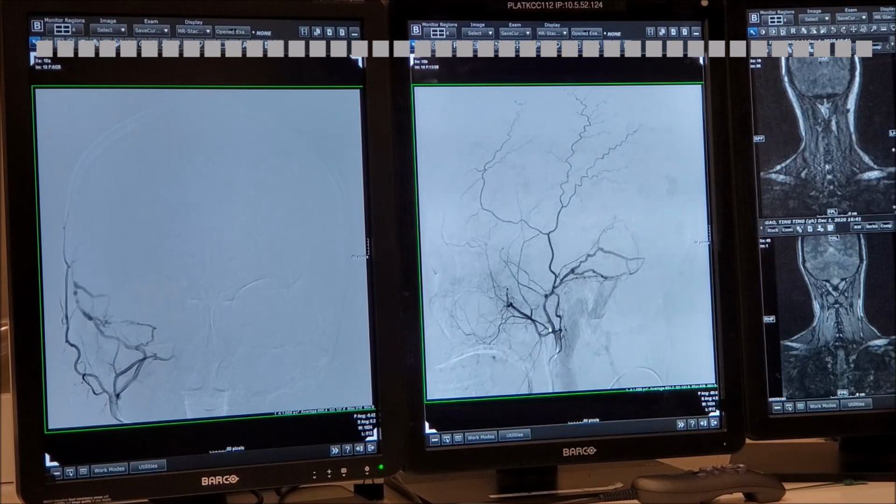When I saw what you mentioned, accessory meningeal, I thought this is the middle deep temporal, because I was always thinking... here's the inferior dental. I forgot the deep course of the internal maxillary, then the mid deep temporal will be in the same trunk. When it's superficial, they will have a different branch.